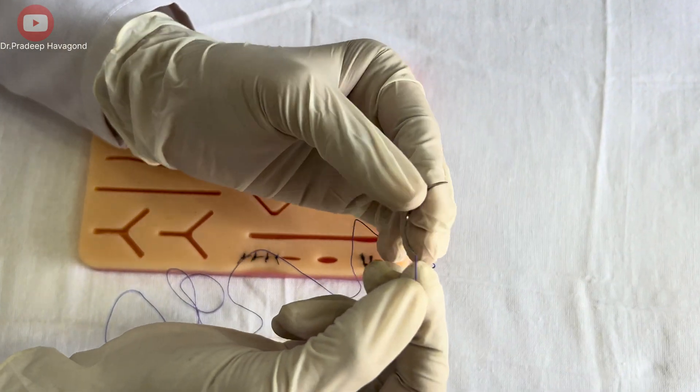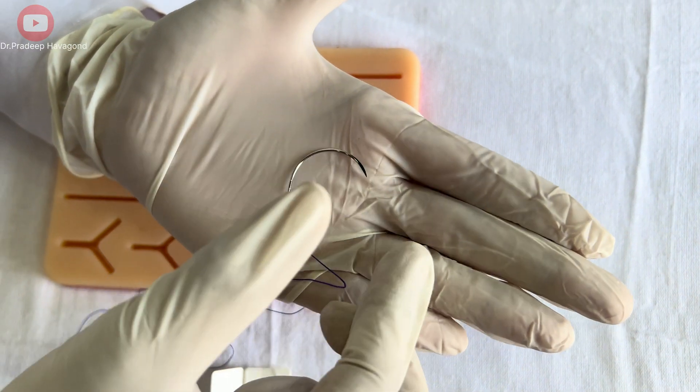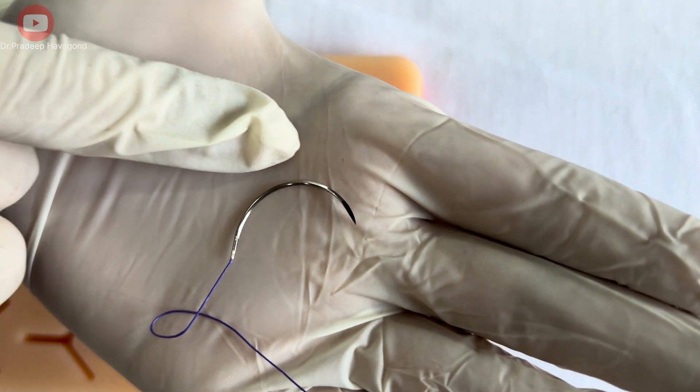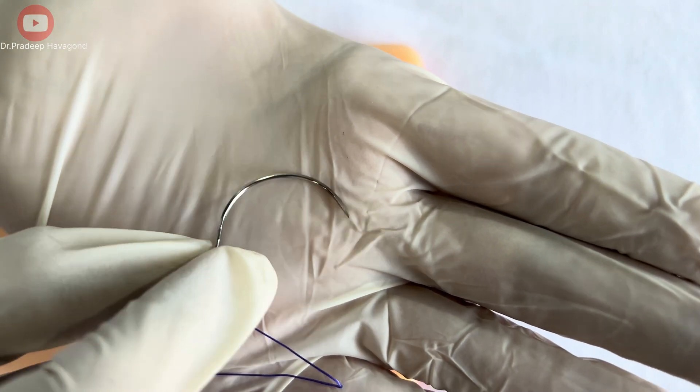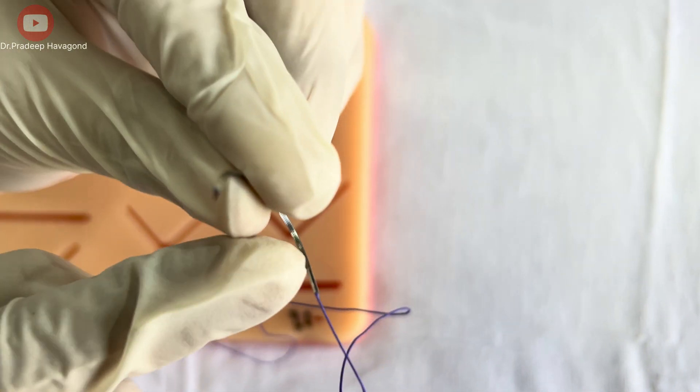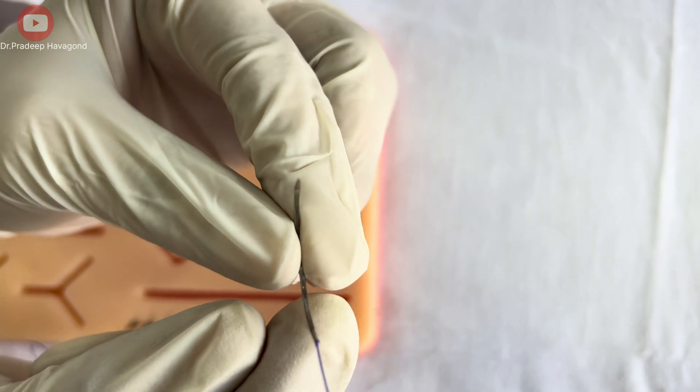The needle is held at two-thirds distance from the tip and one-third distance from the swagged end. So here, I will show you holding the needle in the needle holder.